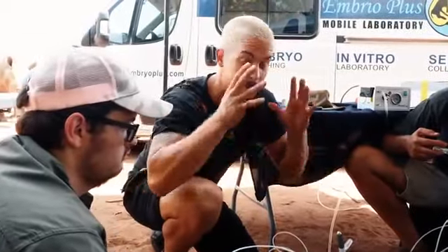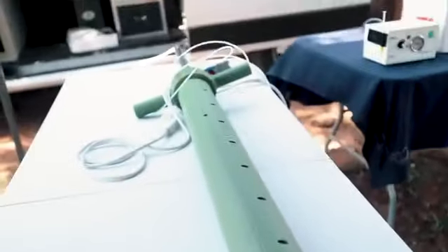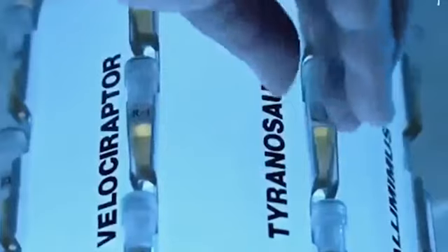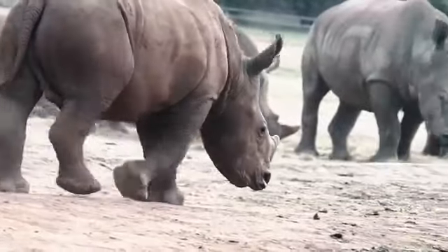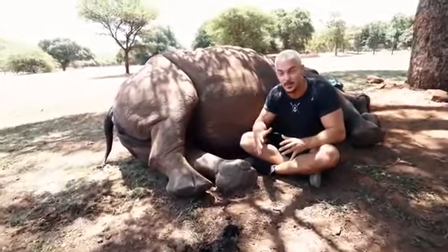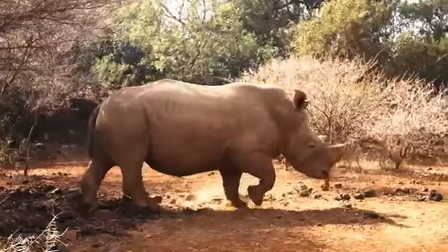Let me explain this procedure in a little more detail. Dr. De la Ray is using this machine to extract the eggs out of the rhino. These eggs will be sent to a laboratory where they are injected with male sperm from a male rhino. Once they achieve creating that embryo, they will put it back into a southern white rhino which will carry the baby — and that baby will be a northern white rhino. This is how we can save the species by reproducing them one at a time.